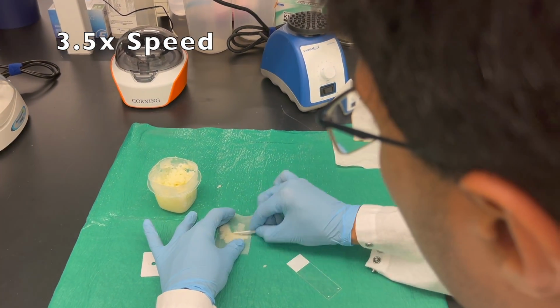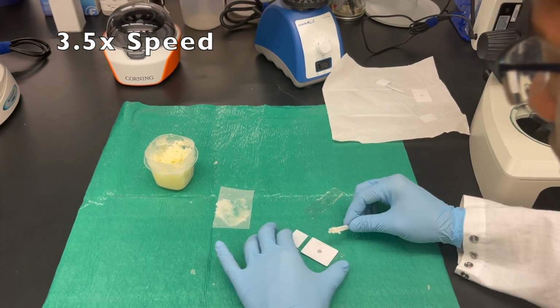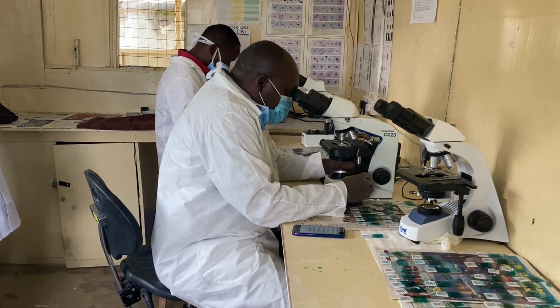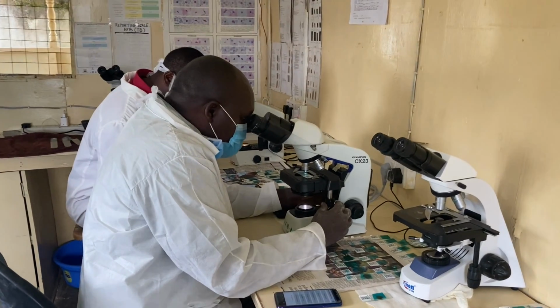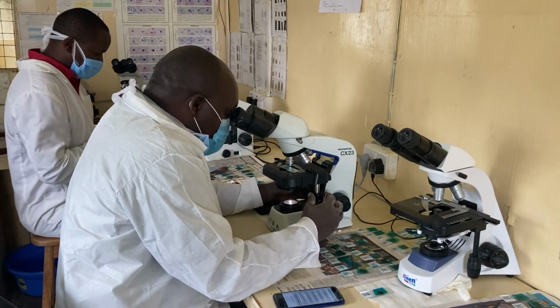The Kato-Katz procedure is performed by lab technicians in developing areas and is not sensitive or consistent enough for the accurate diagnosis of community-wide infection. These issues are due to the fact that the method relies on manual counting of the parasitic eggs, leading to analyst fatigue and inaccuracy given poor egg visibility and human error.